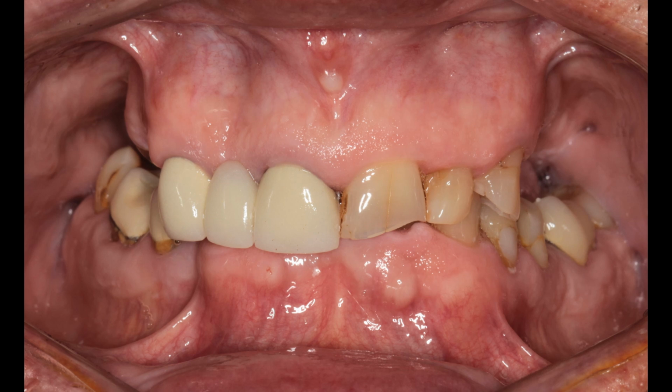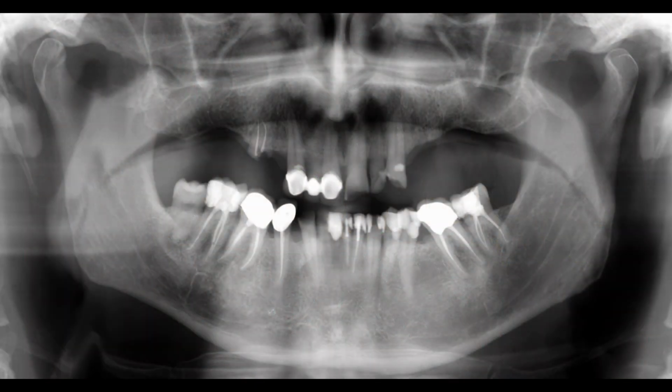He's got more connective tissue volume than most people by a lot. And again, I'm looking at bone volume, and surprisingly, even where he's missing teeth, his bone volume is quite good.